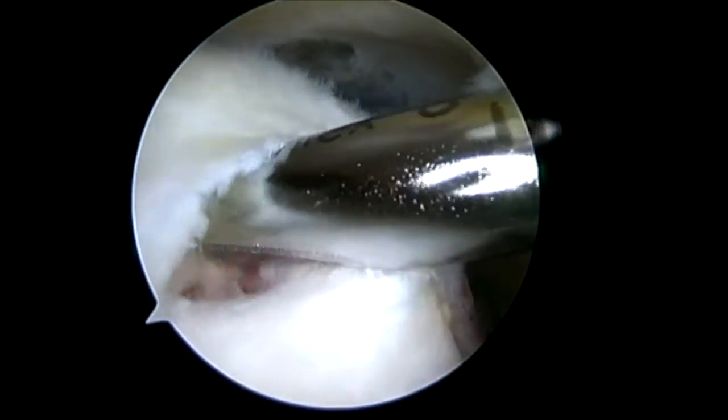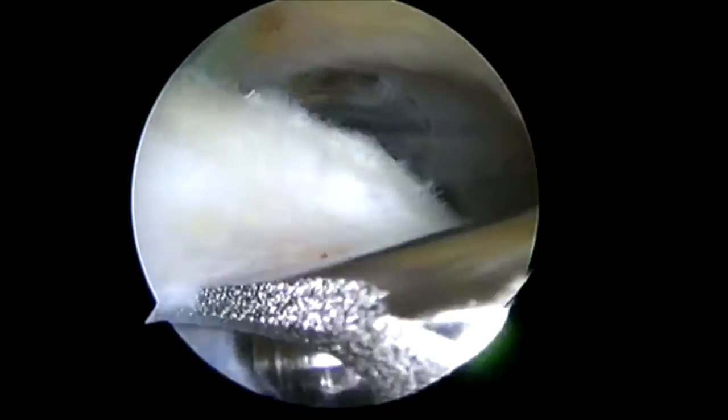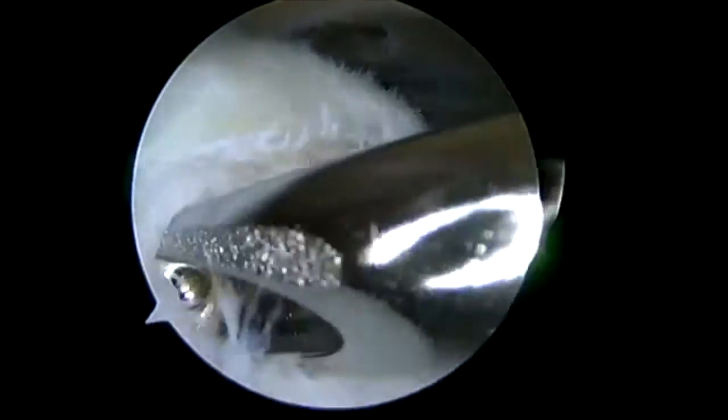In this case, this patient has a tear of the supraspinatus tendon. We can see that the tendon, however, has a much greater tear than was demonstrated on MRI. What we also know is that the patient has remarkably deficient tissue.